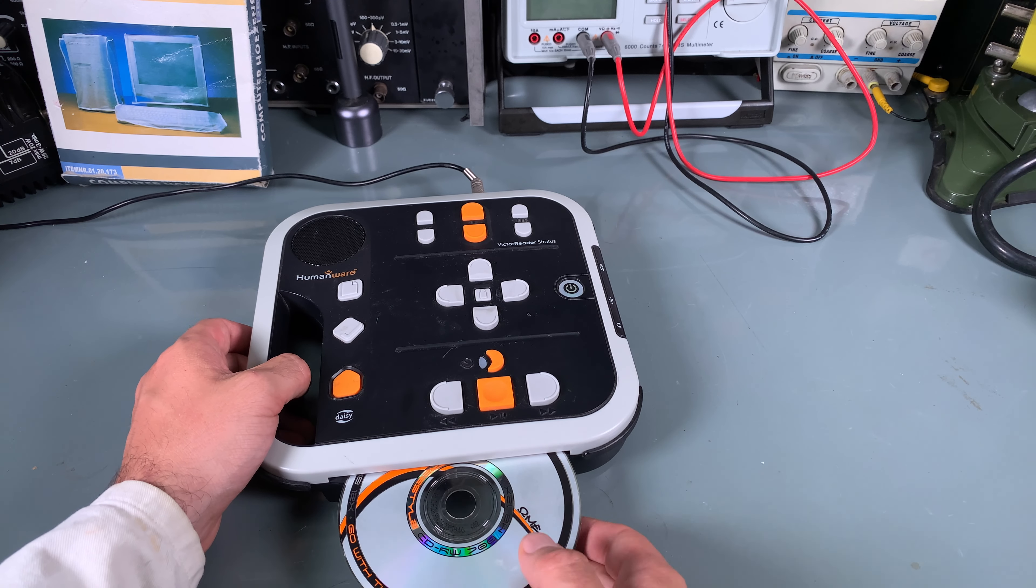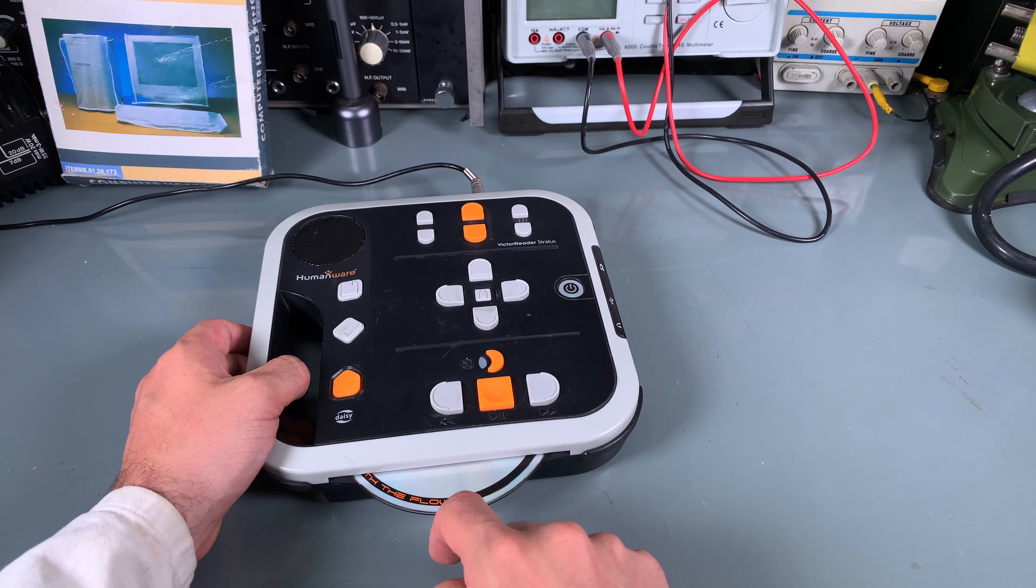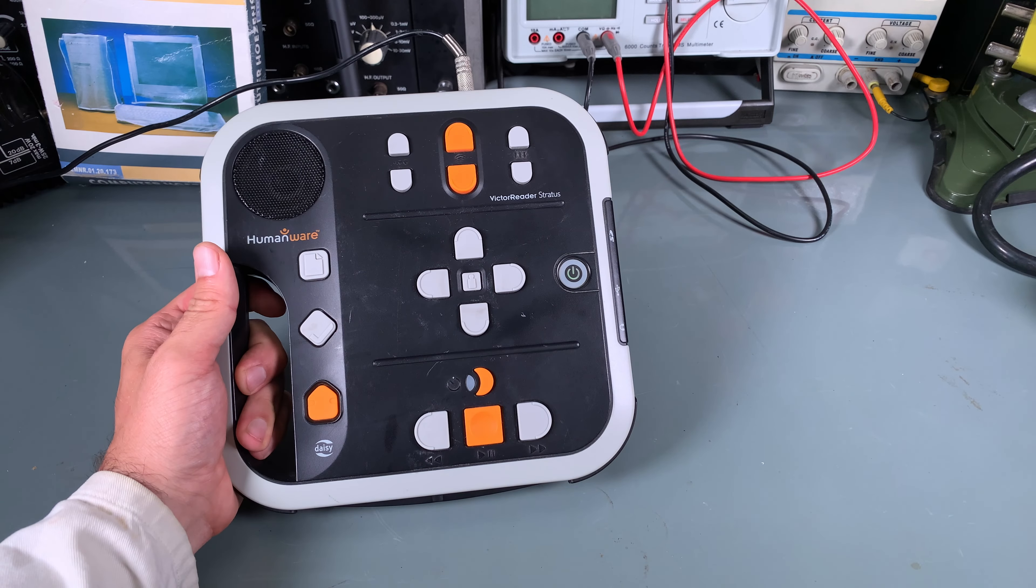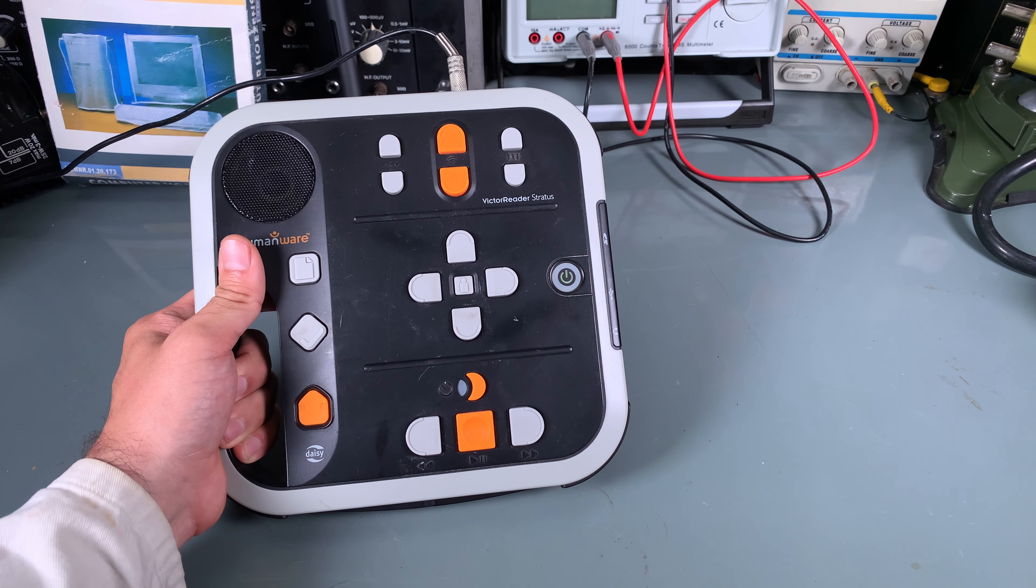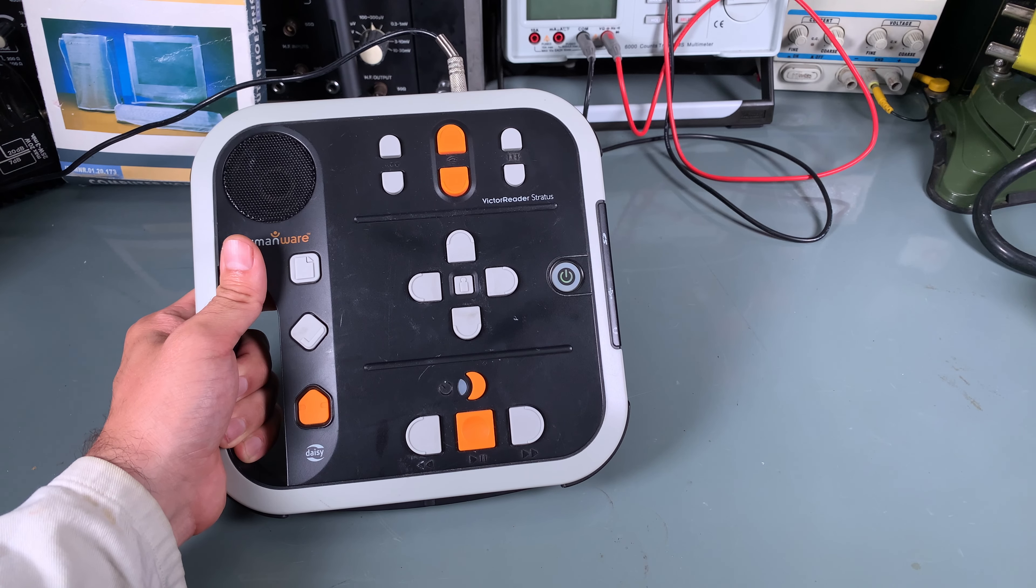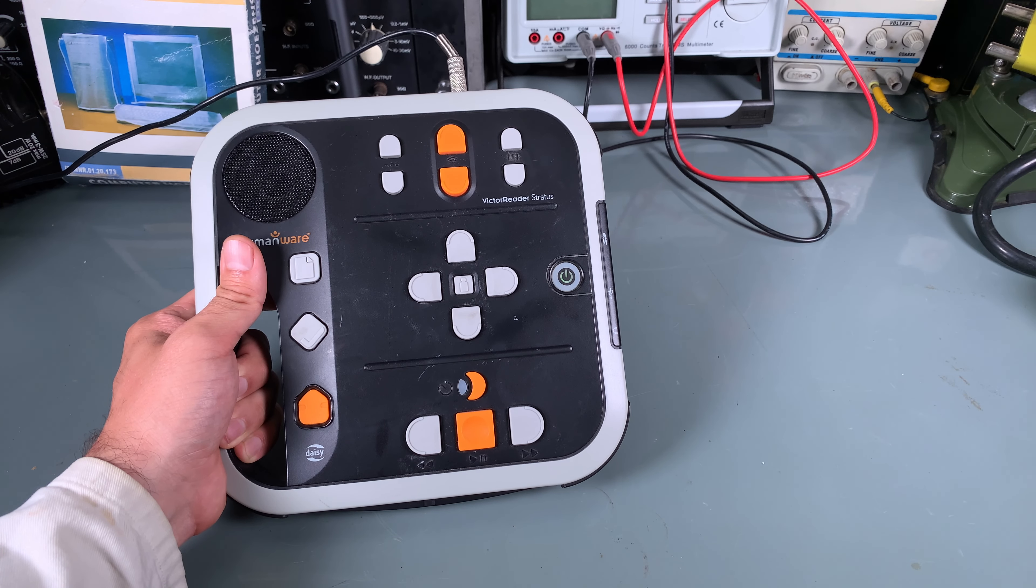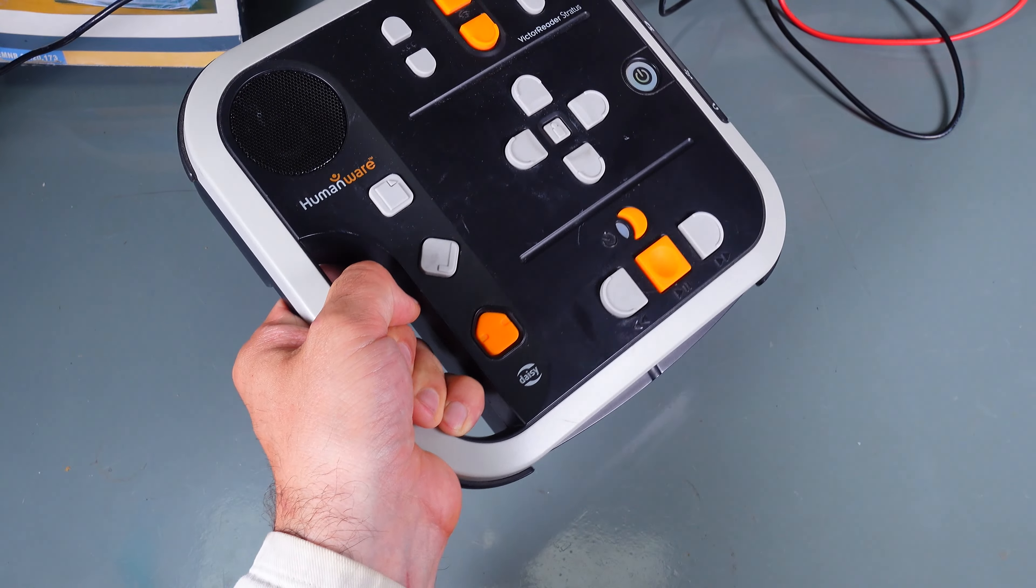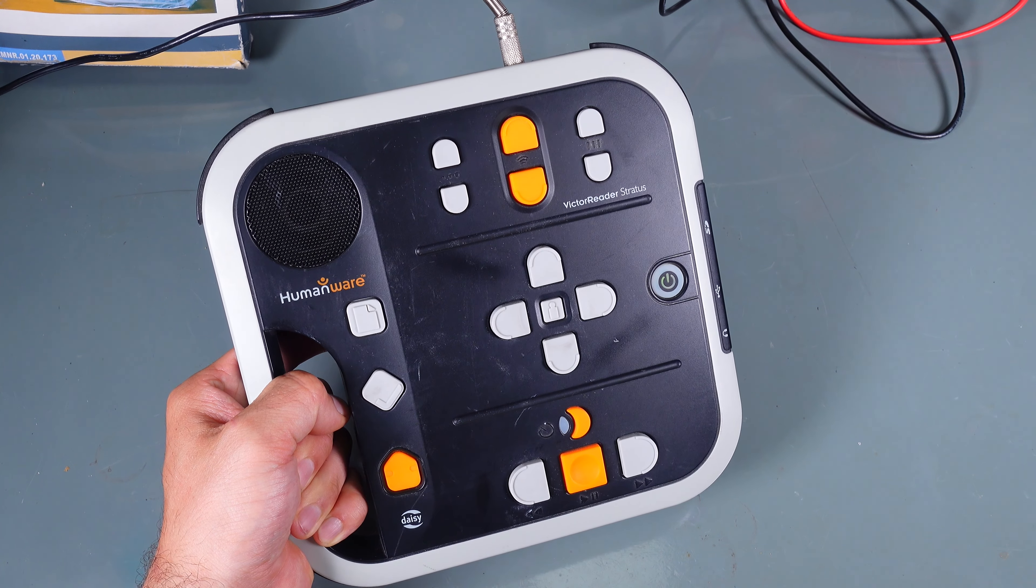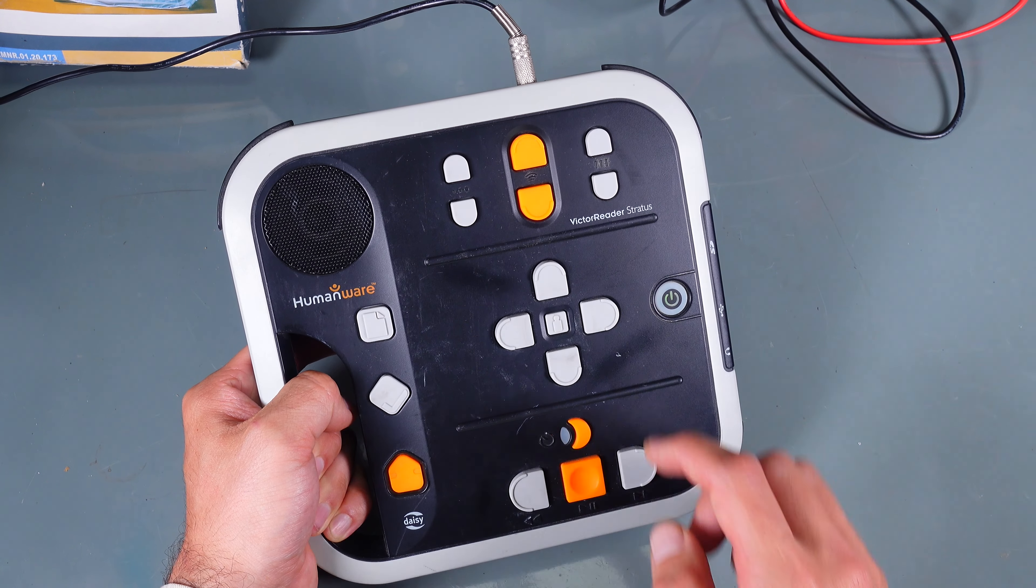I have to use a non-copyrighted track that's allowed for YouTube. You just put the music file in exactly the same way as a regular audio book. As you can see, we've got audio track 1 and the music is playing.